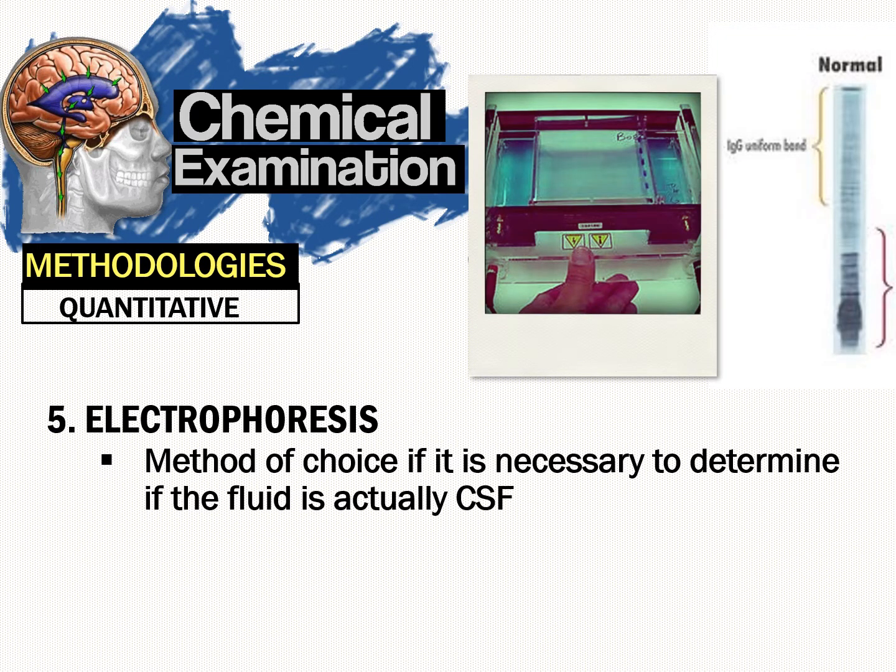The last one is electrophoresis. A normal electrophoretic pattern for CSF has the first band prealbumin, followed by 2 transferrin bands, which actually are transferrin and then the tau. Faint bands of alpha-1 antitrypsin and IgG may also be present.